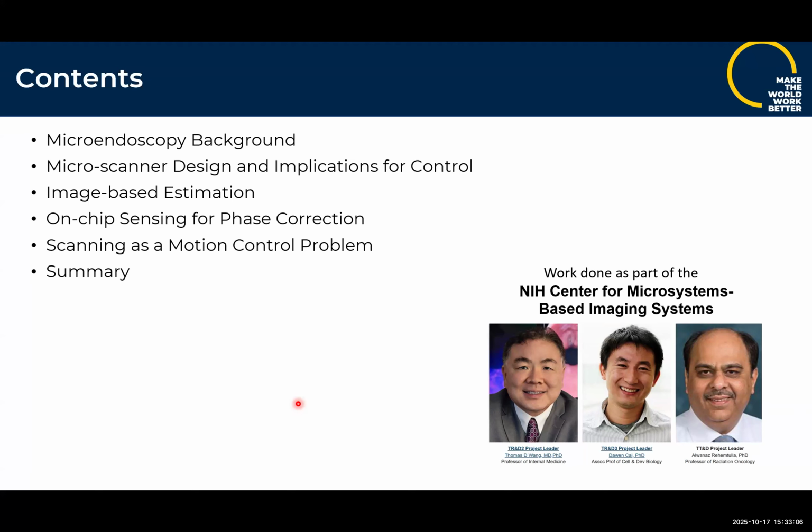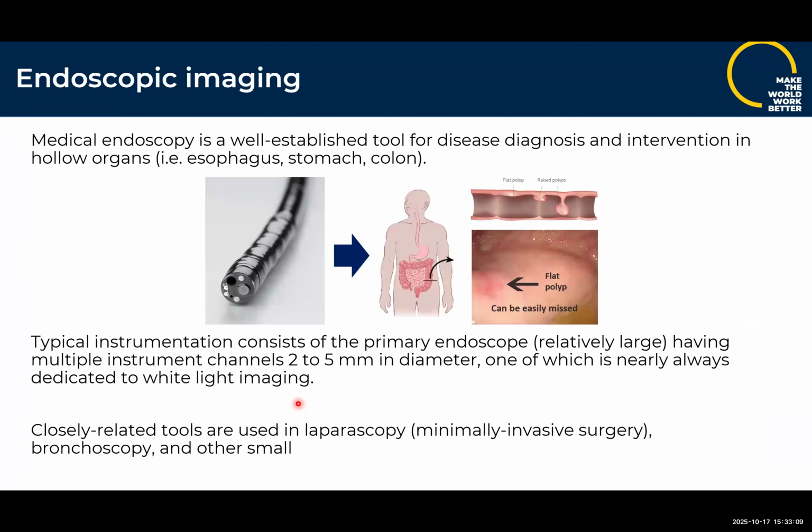And so let me start off at the beginning. Folks are most likely familiar, or at least have heard of endoscopy. Broadly speaking, endo just means inner. So any sort of tool that can be used inside the body, usually by a minimally invasive insertion, but most commonly that means imaging in the esophagus, the gastrointestinal tract, or the colon. And so this is a very common tool for disease diagnosis and intervention. Various diseases, Tom particularly works on cancer, and most of our collaborators work on cancer, but other diseases as well.